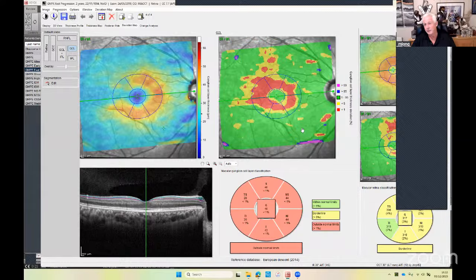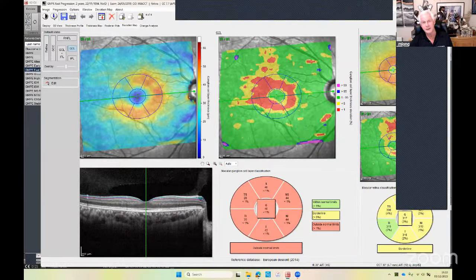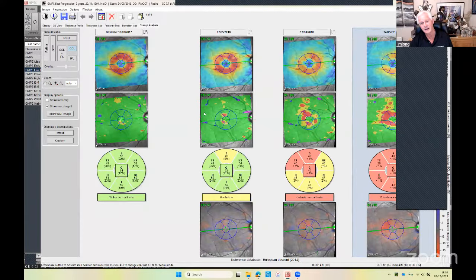Unfortunately, I was collecting lots of cases and I didn't realize what I was looking at that time, thinking that this was just a fast progressing glaucoma. And I'm not sure that it actually is. Now I look at those patterns. But just to give you the idea, what you can see over a period of time. You could look on the whole page and see the progression over that period of time and see what's happening. And that's a very fast progressing, especially even from a glaucoma perspective.